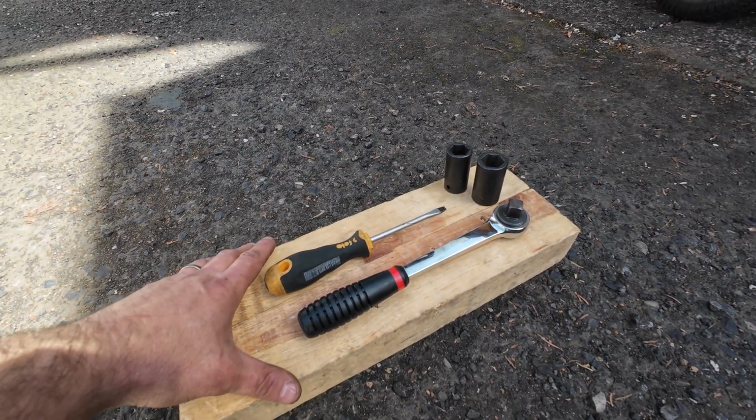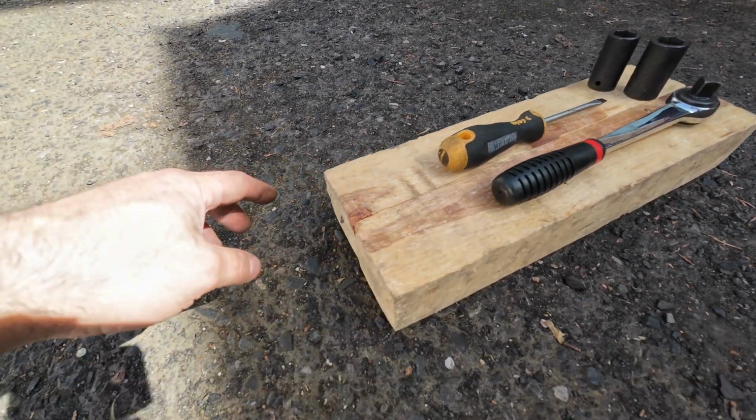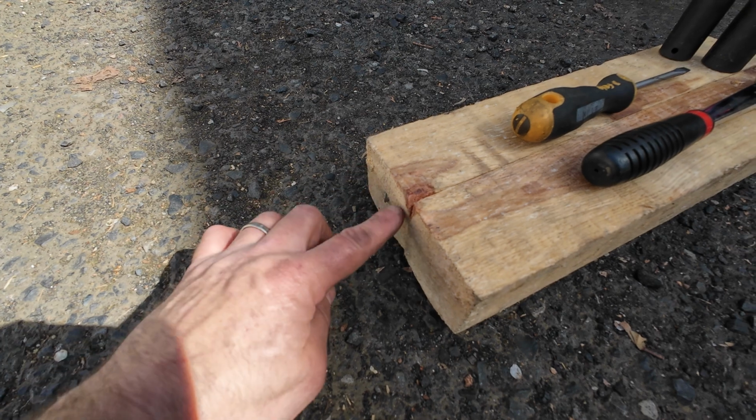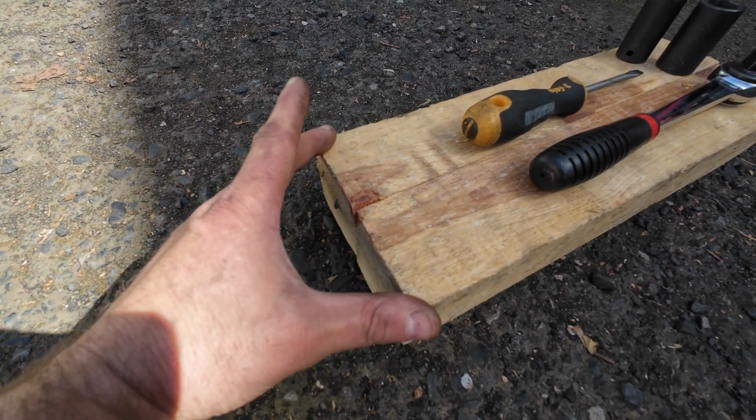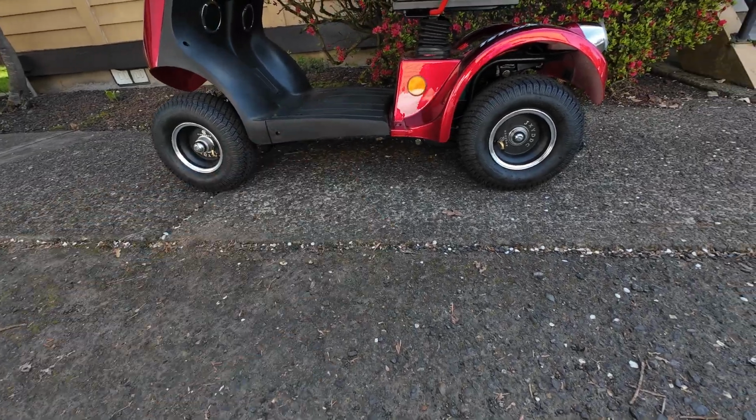I'm also going to use a wooden block. This is a 6-inch block that I made out of 2 blocks. Each block is 3 by 3 inch, so I need 6-7 inch of clearance for the lifting point.